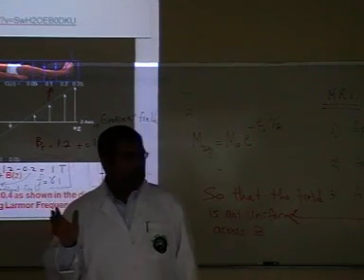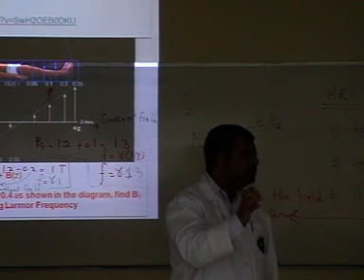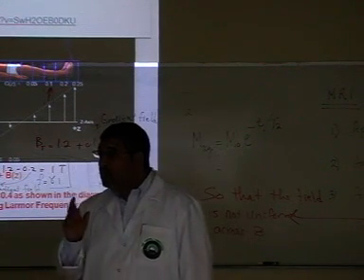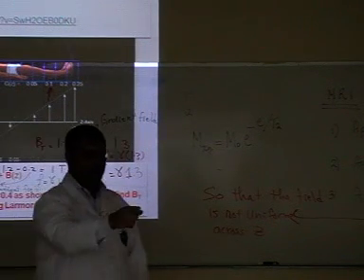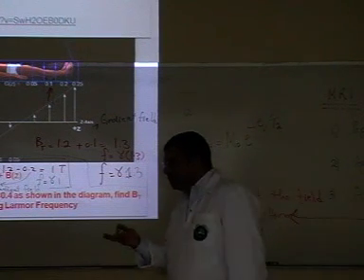No. Why not? That's right, because we're dealing with something in the RF range, which is very low frequency, way below the ionizing range of electromagnetic waves. So it's safe, of course. The only thing about it is that it's too expensive.